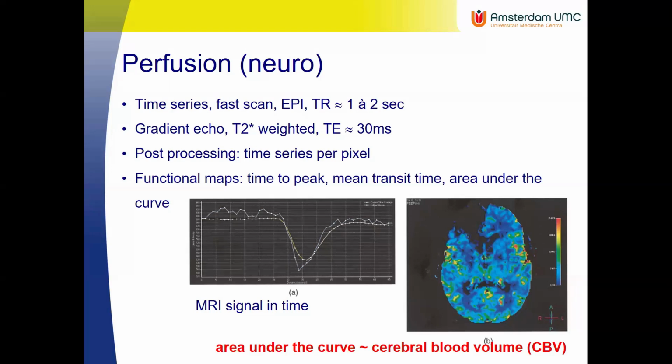That was actually in my slide on the first presentation, the last bit. So you don't really have to understand the mechanism, but it's good enough if you just know that the presence of contrast agent reduces T1, T2, and T2 star. And we're not looking at the contrast agent itself. We're not getting signal from the gadolinium. We're still getting the signal from the water surrounding the gadolinium.